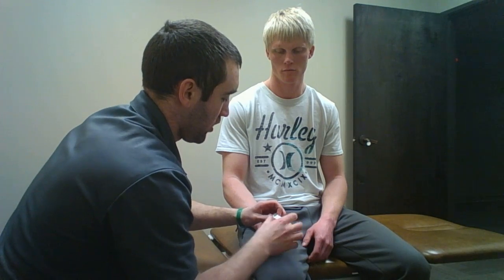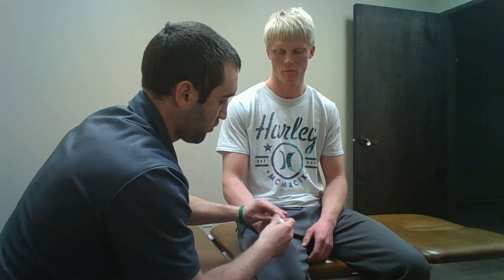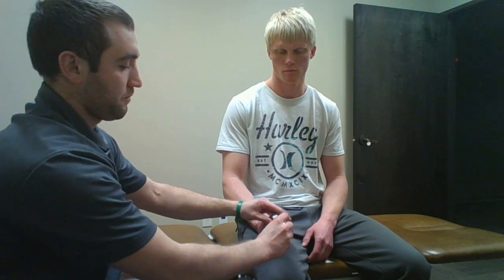Just like that, to hold the splint in place. The splint will be in 30 degrees of flexion to begin with, and we want that on for three weeks. Following the three weeks, we will gradually move 10 degrees each week into extension, achieving full neutral position by six weeks.